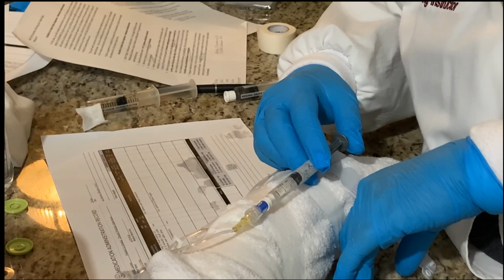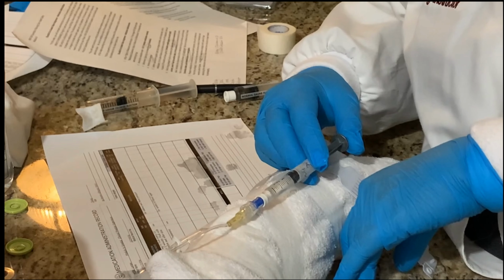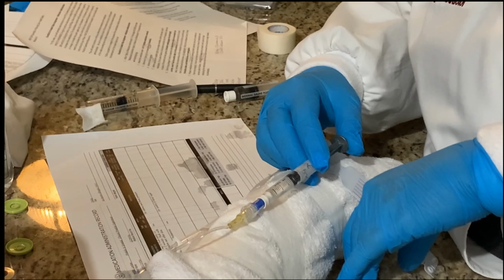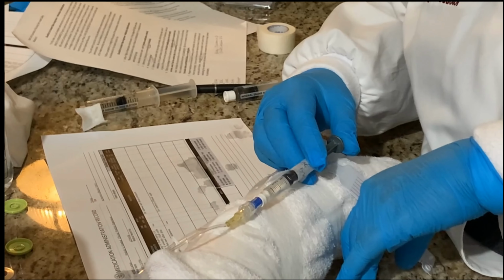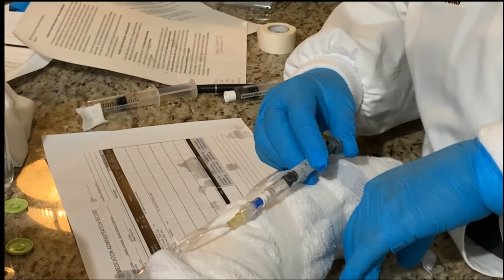And so when you're giving this over 2 minutes, you're thinking, if I have 2 mLs, then at about 1 minute, I should have 1 mL in. So you want to give it very slowly. Not all medications are given at the same time. Some medications are given over 1 minute or 30 seconds. Some medications are given over 5 minutes.